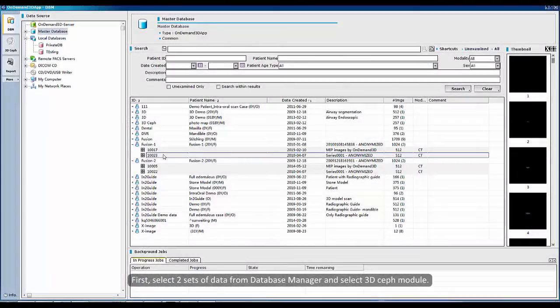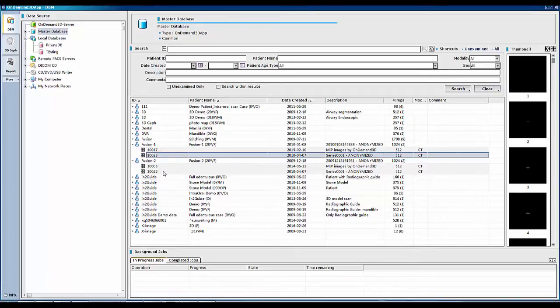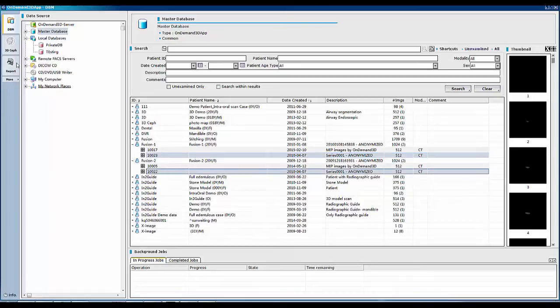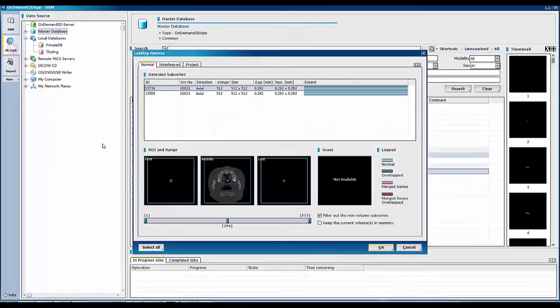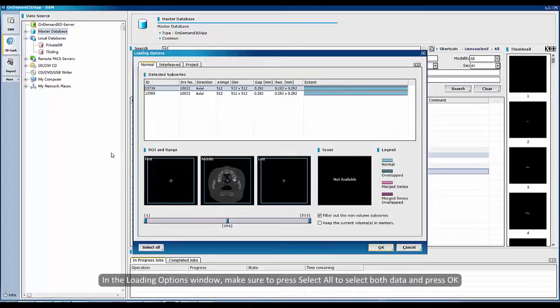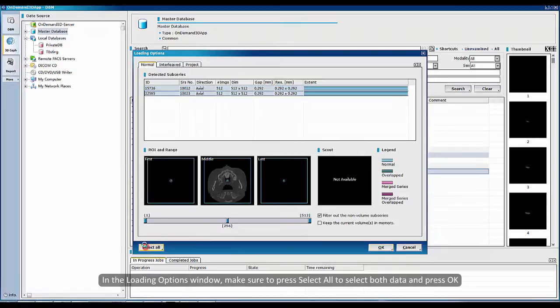First, select two sets of data from Database Manager and select the 3D Ceph module. In the Loading option window, make sure to press Select All to select both data and press OK.